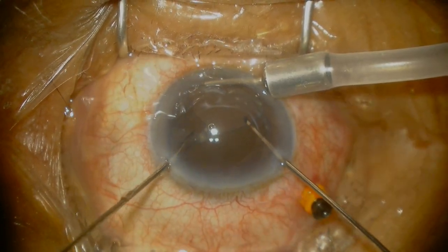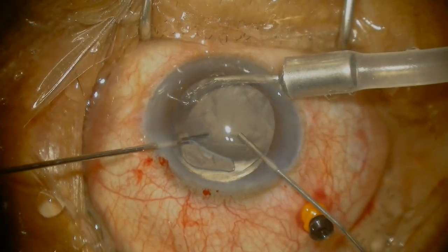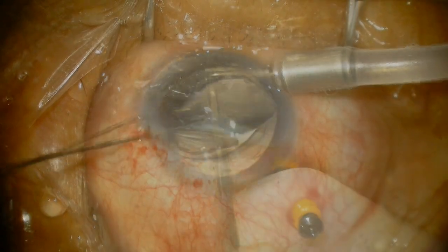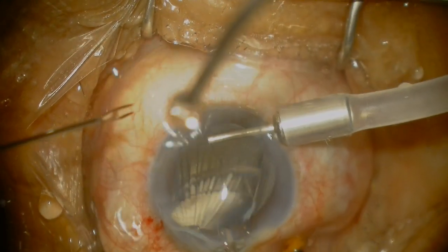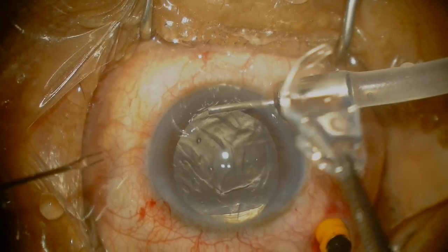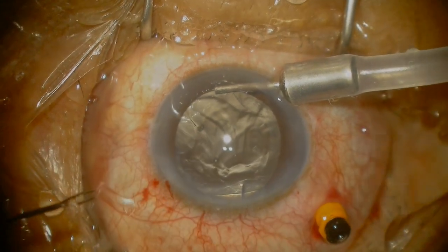As you see here, I use 25 gauge angled grasping forceps to grab onto the intraocular lens. As you see, the haptics are flipped. Having done a pars plana anterior vitrectomy with triamcinolone, I'm explanting the lens now. I've extended the wound to a 3mm incision and subsequently you can see that the lens does come out in one piece.